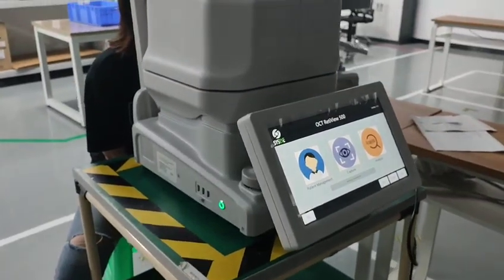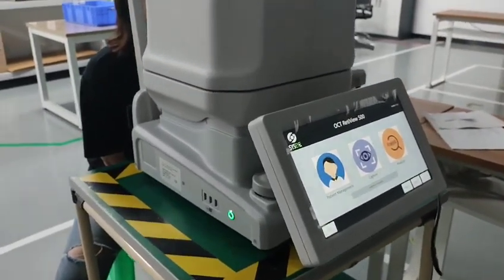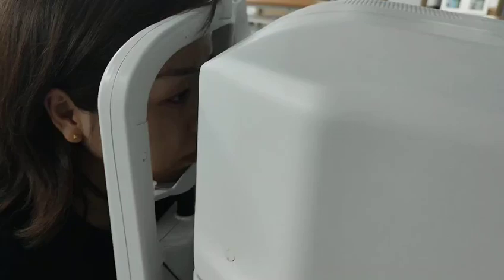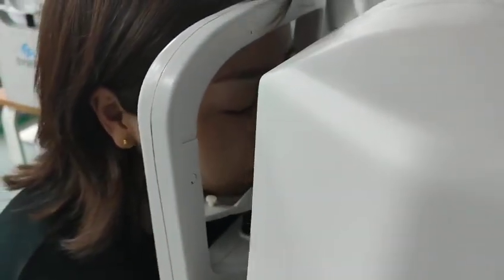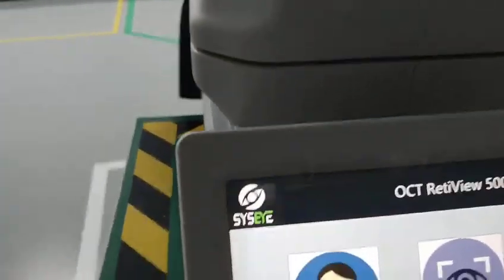Okay, now I will show you how to operate the OCT. First step, you need to ask the patient to sit straight, with the head, forehead and the chin tightly touching the chin rest. Please make sure the forehead tightly touches the chin rest. And then, first step, we input the patient information.